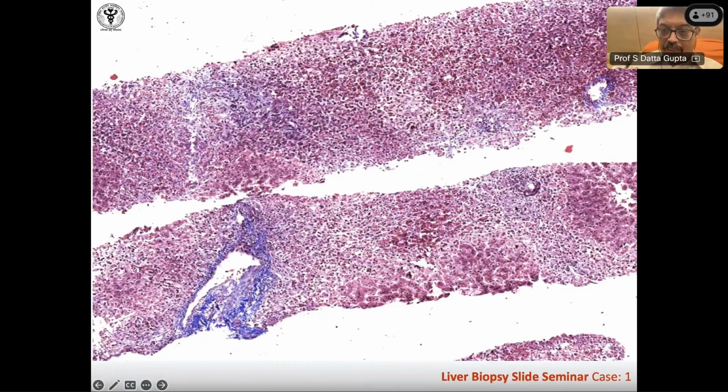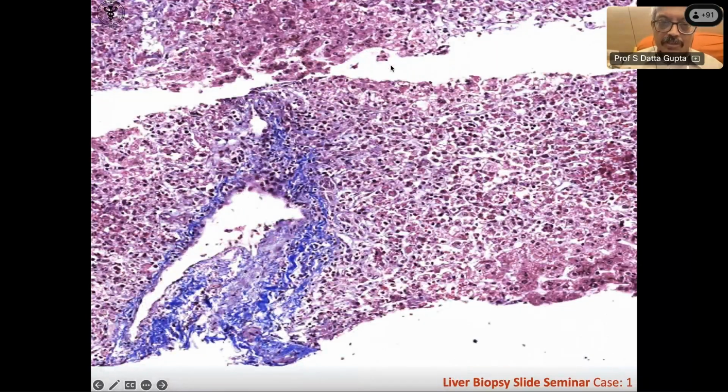So it looks as if, histologically at least, it looks like acute hepatitis, and there is bridging necrosis in the sense from one vascular area to another vascular area, right? And here's the portal tract. So it's almost portal, central, portal, and so on and so forth. You see, this one to here. The same thing here, you're not sure.